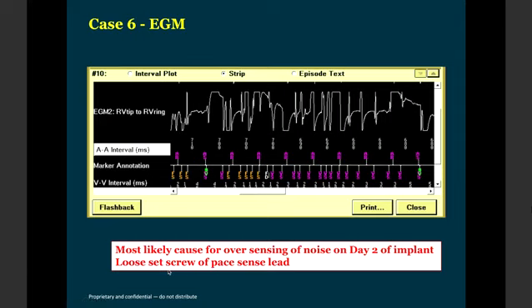So Mukund, I have SVT, VT discrimination and multiple other things. I'm intentionally not going into that. I request Medtronic, if possible, to have some other speaker, or me, or even Mukund for that matter, to continue some of the extra troubleshooting: how the current generation devices differentiate between SVT and VT, both in single chamber devices as well as in dual chamber devices.